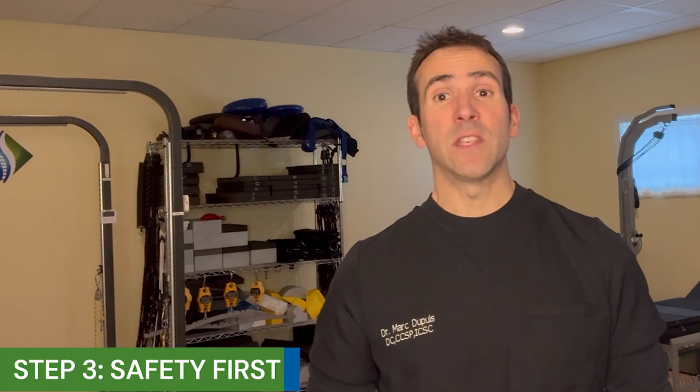Number 3, safety first. Although this therapy is highly effective and incredibly safe, there are some conditions where contraindications exist, and these individuals unfortunately cannot safely undergo non-surgical computerized traction spinal decompression therapy. Some of these conditions are fractures, obviously. If someone is pregnant, they cannot undergo such care. If there are spinal infections present, those are the top 3. A few more exist as well. So that's something that if you find a clinic in your area, that discussion needs to be had with the provider there. Also, prior to undergoing any non-surgical traction decompression therapy, a thorough exam needs to be undertaken so that way the provider and the patient know that they truly are a fit for this therapy.